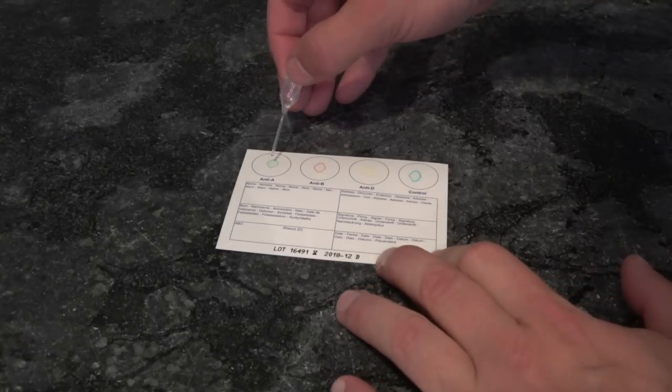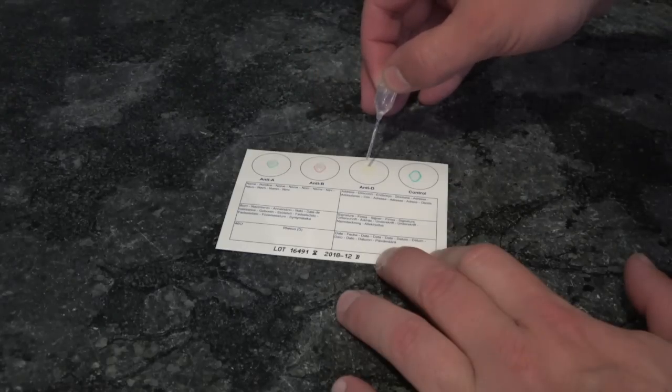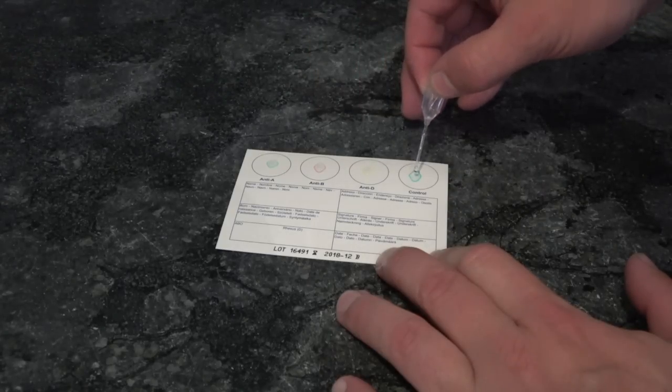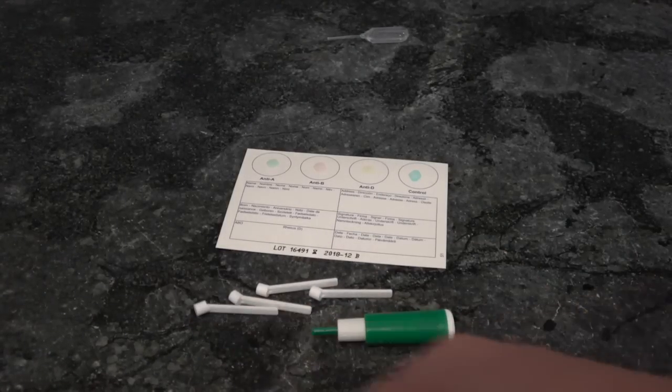First thing I did was fill the pipette with water and I'm going to place one drop on each of the colored dots, and you want to make sure you don't touch those dots with the pipette. Next, I get out my Eldon sticks so that they're ready to use.